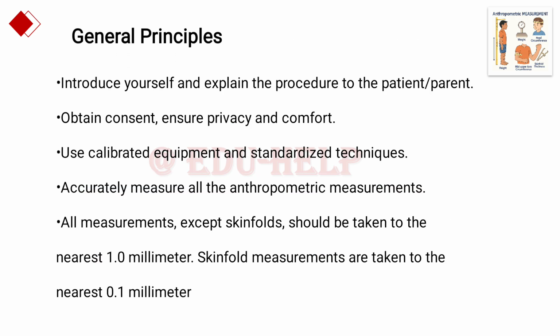Students should consider certain general principles before starting the demonstration. He or she should introduce himself or herself and explain the procedure to the patient, subject or the parents of the subject. He should obtain consent and ensure privacy and comfort of the subject.